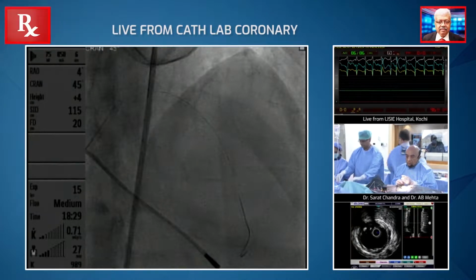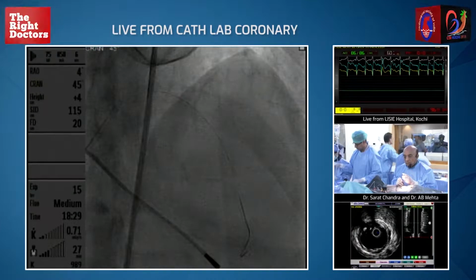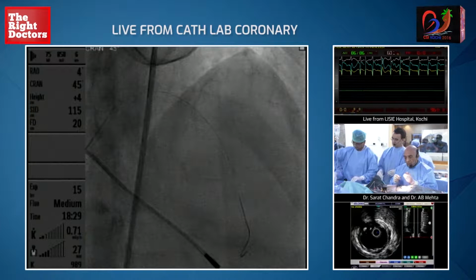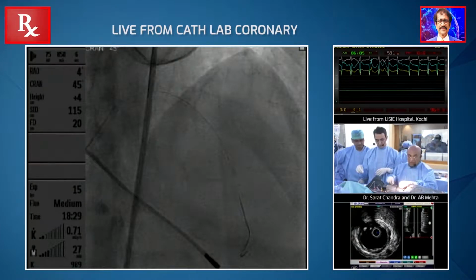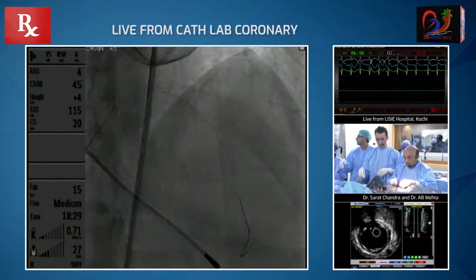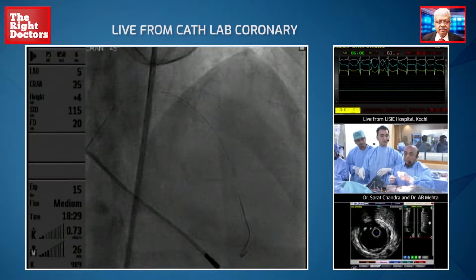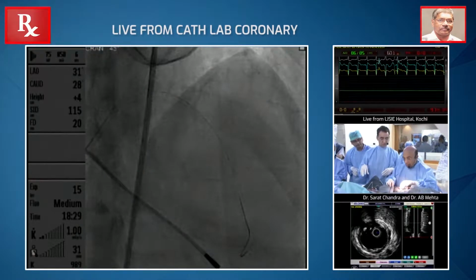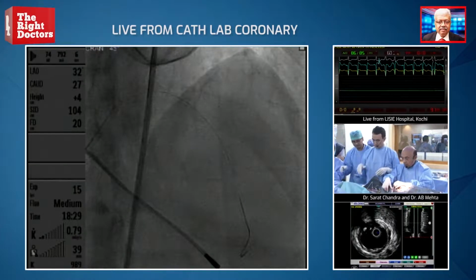That's it. Yes. Okay. So this was us equalizing. This is us equalizing. And this was the initial. And now you see the iFR taken with the wire in the PDA, and where the green is, you can see it's sampling. Next, please.